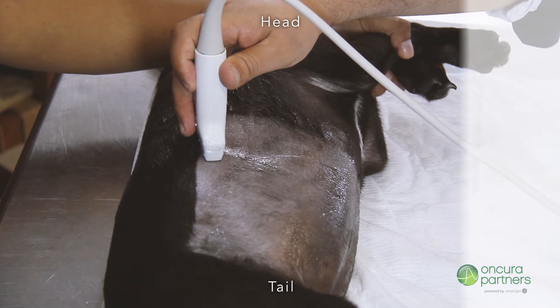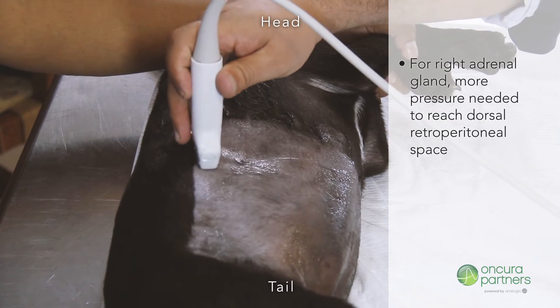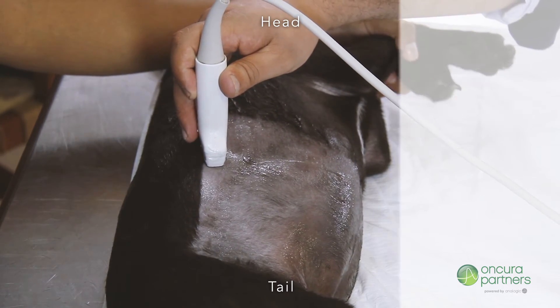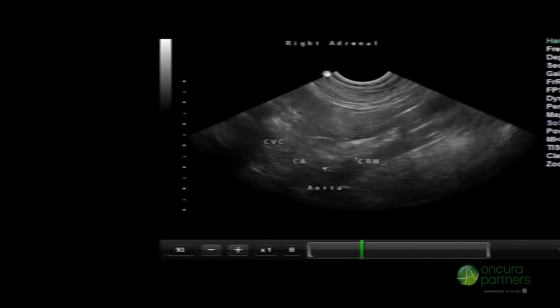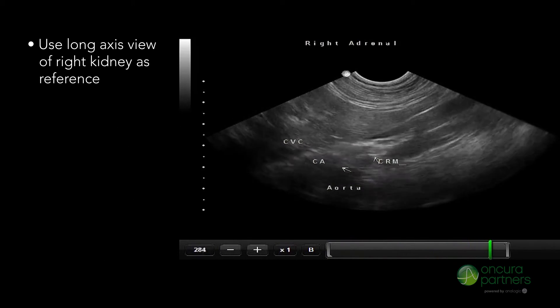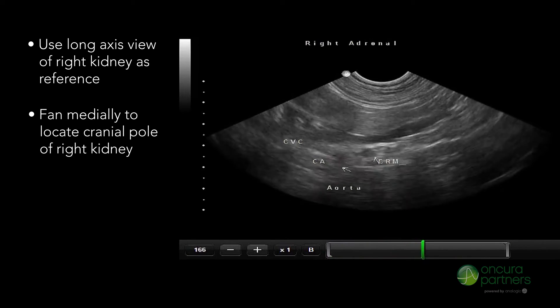Please note that when searching for the right adrenal gland, more pressure will be needed to reach the dorsal retroperitoneal space compared to the left adrenal. Use the long axis view of the right kidney as a reference point, then fan medially to locate the cranial pole of the right kidney.